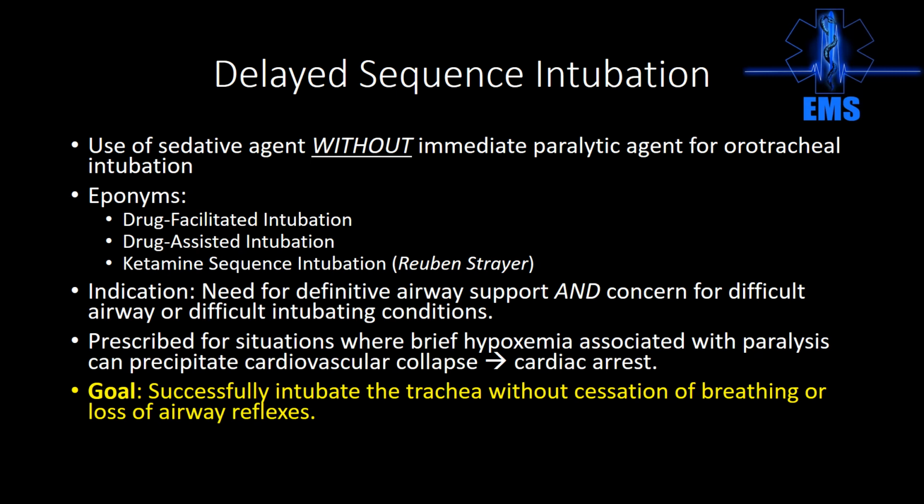Okay, delayed sequence intubation. This is the use of a sedative without an immediate paralytic agent for oral tracheal intubation. Notice it's immediate. We talked about RSI, and that was bang, bang: sedative followed by paralytic followed by tube. This is sedative followed by something else.